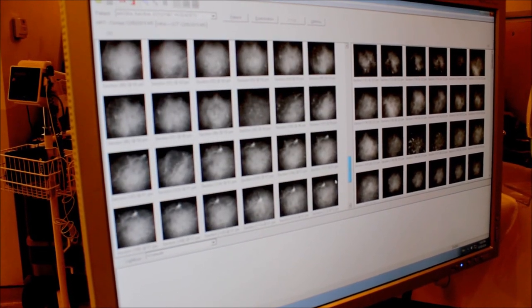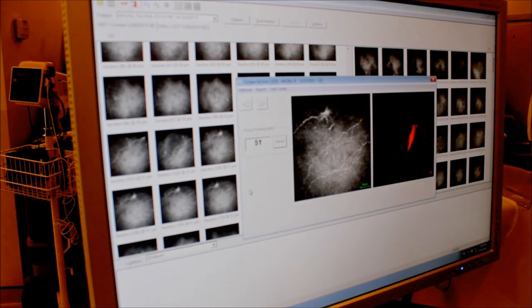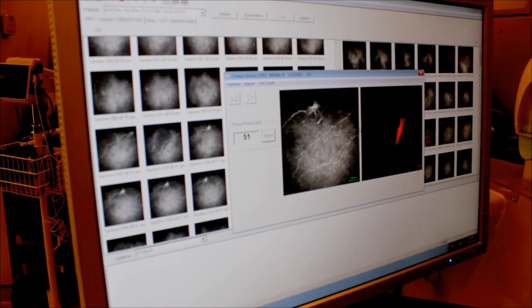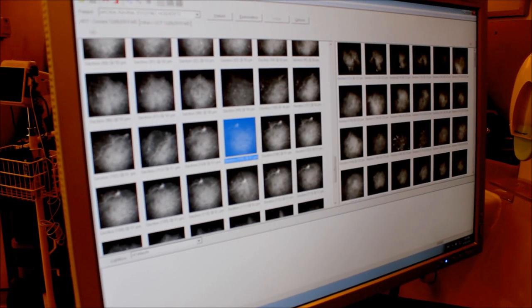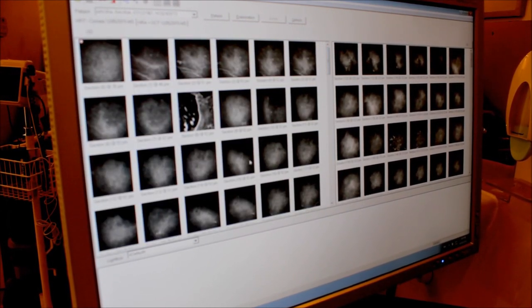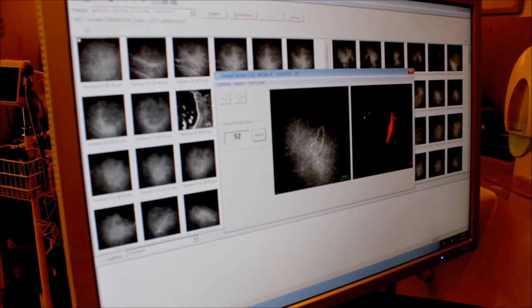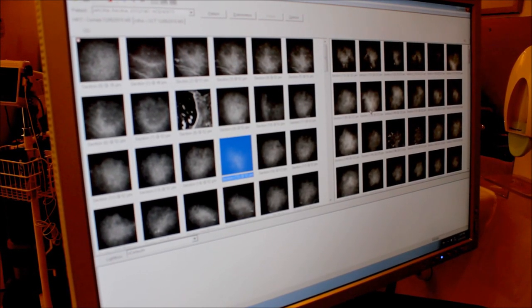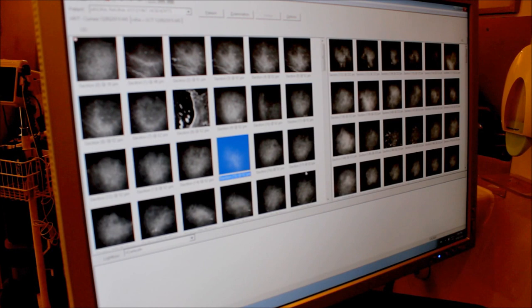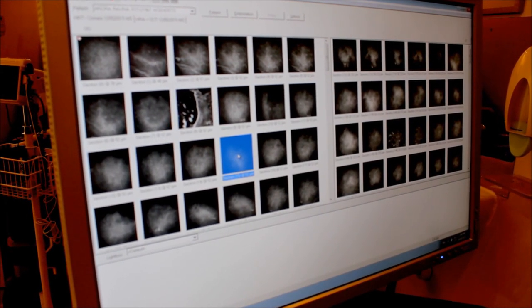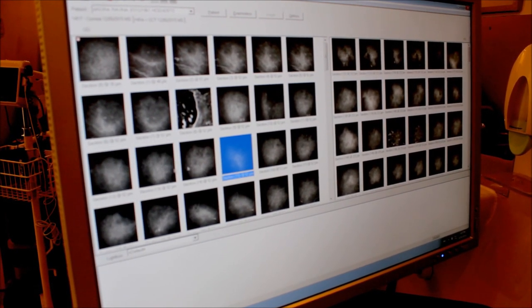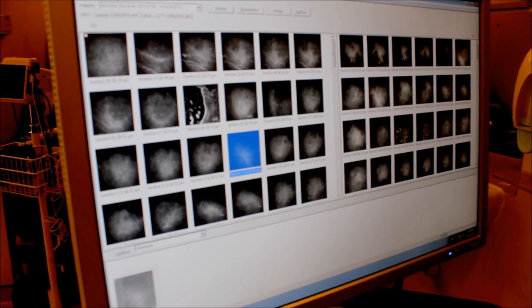So what we see in this patient, we see images like this one, where perhaps we can see about four nerves, but we also see images where we can see about one nerve. So what I want to do here is to create a range which represents this variability. I would choose one image as a minimum — in this case, this image perhaps, where we can see one nerve.